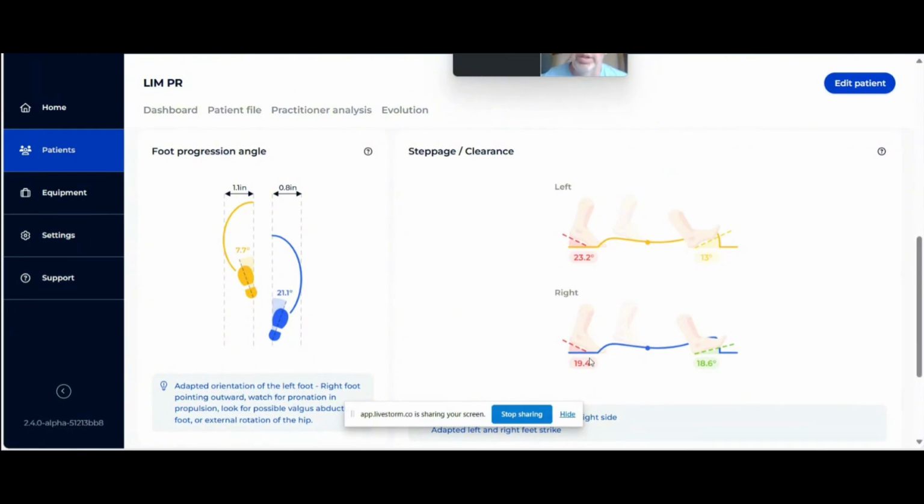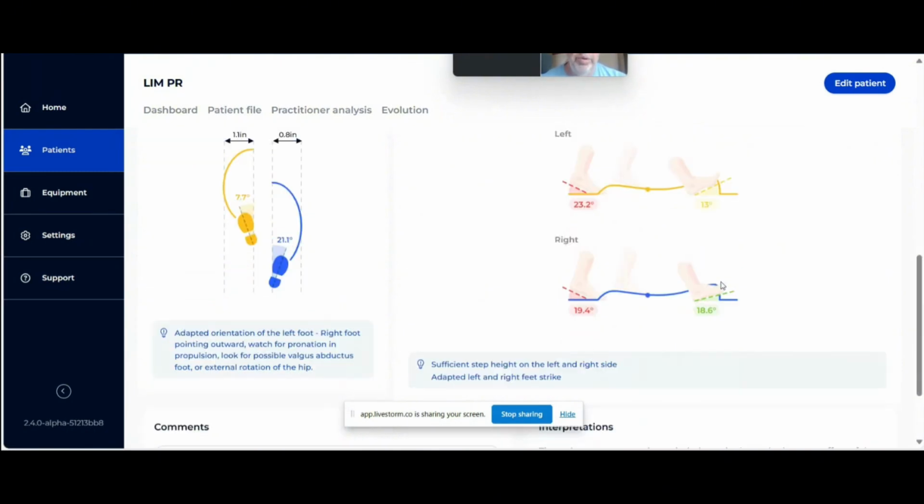One of the reasons why she also has a shorter step or stride length, and this might give you some implications as to some of the things that you're going to do about it. We see close to sort of a normal heel strike. And so one of the things that we do see as a result of that, remember that these people tend to have an increase in hip flexion. And I didn't even allude to the little video that I had on that last slide, where they tend to take a little bit of a hunched over position. And it's typically compensatory as well as being associated with weakness.